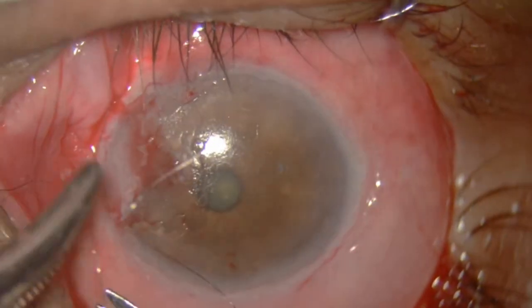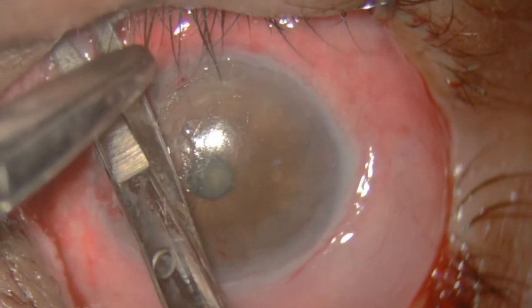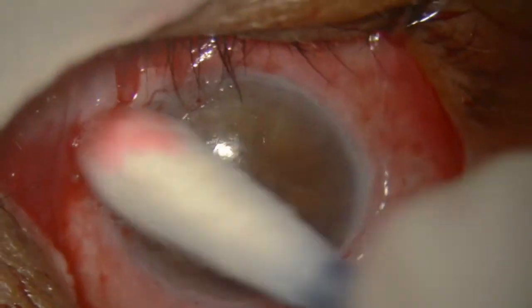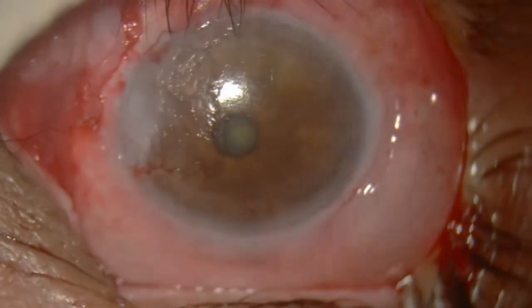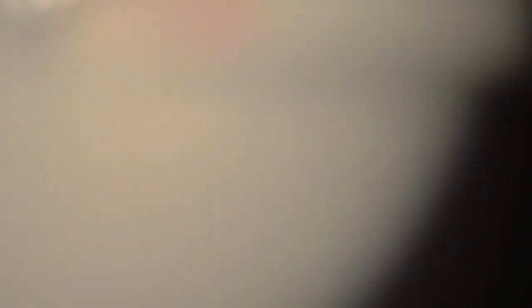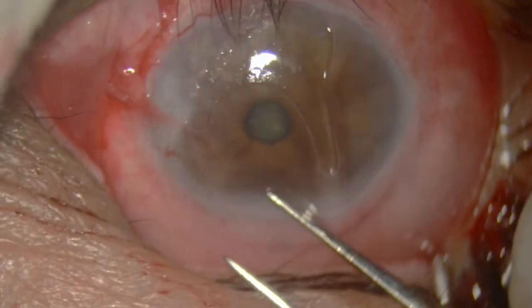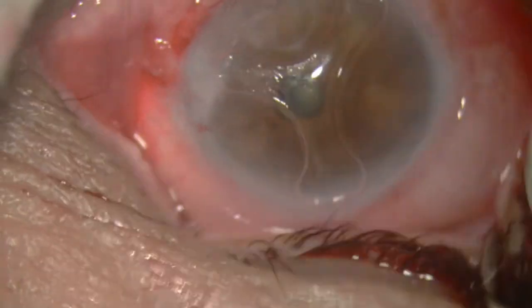So all this is done. The suture is cut right on the knot. To make the patient comfortable, take a contact lens and place it on top. That is all the surgery needed for a huge recurrent pterygium.